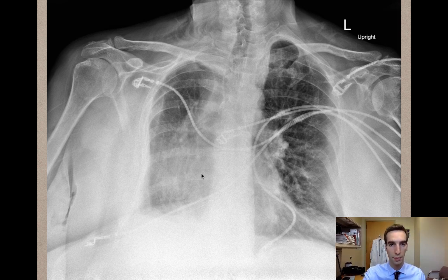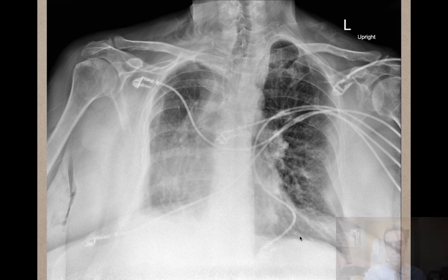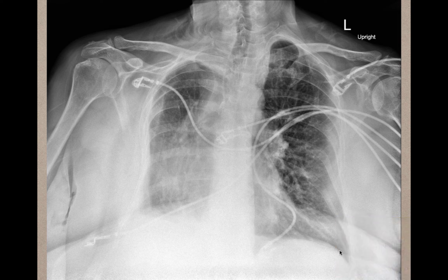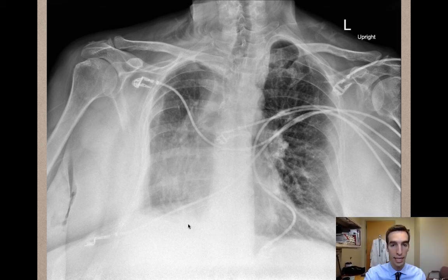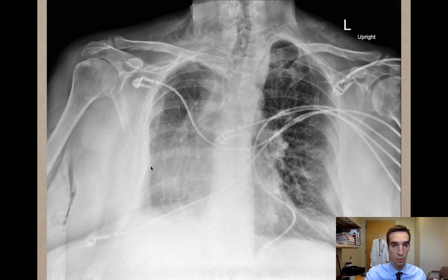The next part of the mnemonic is the diaphragm. Looking at the diaphragm, you can see that it's smooth on the left side with a nice costophrenic angle, but on the right side the costophrenic angle is not present. It could be that there's a pleural effusion going on.